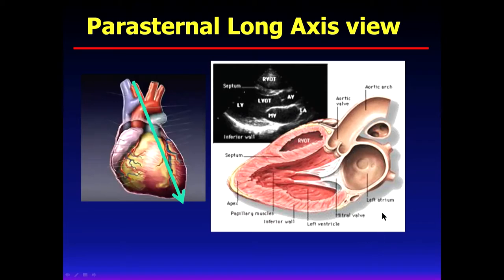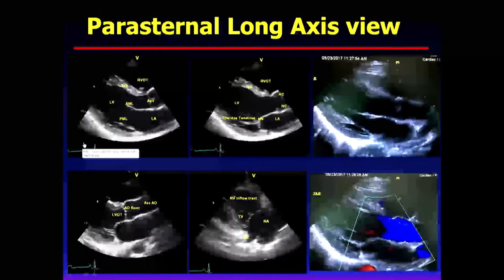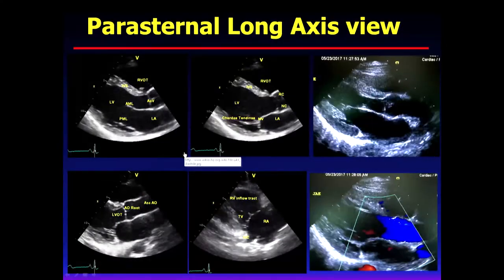Long axis view, we need to look at the axis and then open the heart, and then we can find this structure. So we see here the mitral valve, left atrium and mitral valve and LV, and then septum and RV, and here LV to aorta. And this is just as we learned from Dr. Lee, this is a very well concordant heart, normal. And then we can look at all the structures here with the long axis.